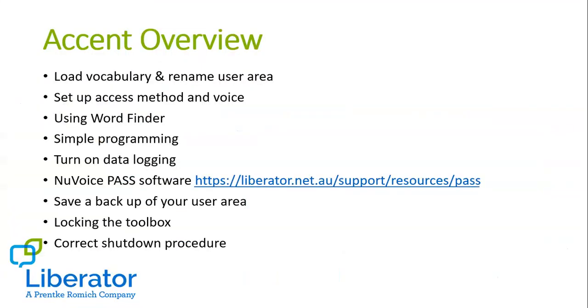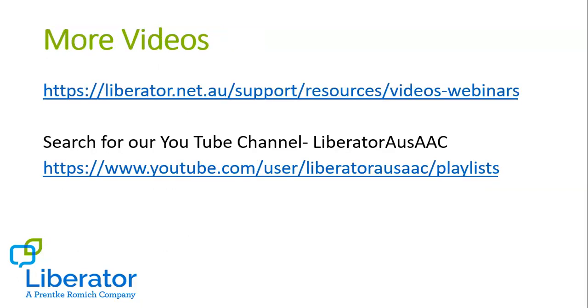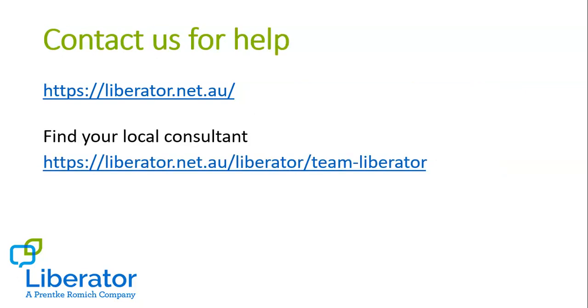OK. So we've been through all those steps. Hopefully that was clear and you're able to set up your new Accent ready for trial. If you're interested in more videos, different step-by-step videos on different functions of the Accent, please head to our website or you can search for our YouTube channel. Our team is here to support you with your trial, so please don't hesitate to contact us. You can get all of our details on our website and even look up the direct contact details of your local consultant that's supporting your state. Thanks everyone for tuning in and good luck with your Accent.